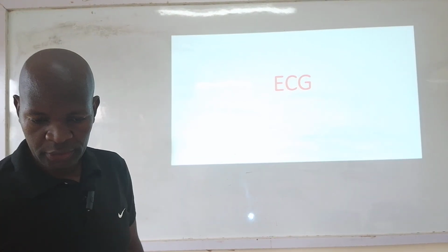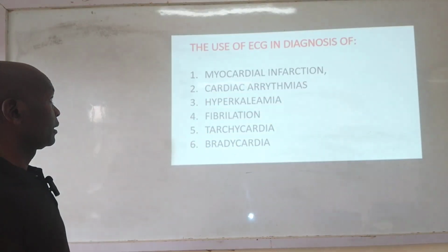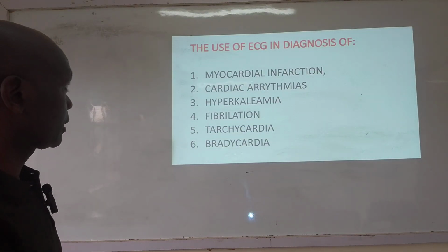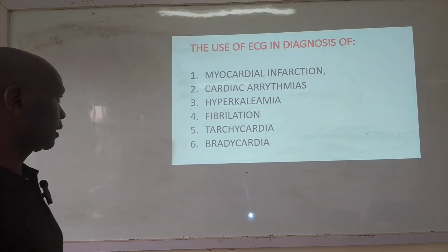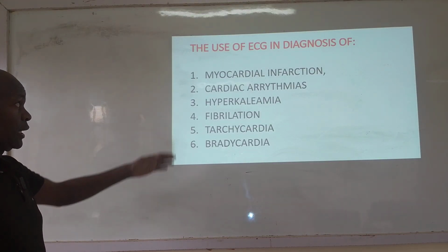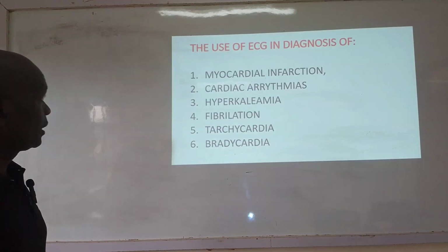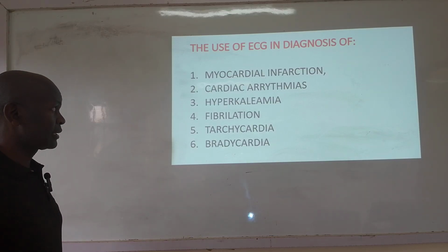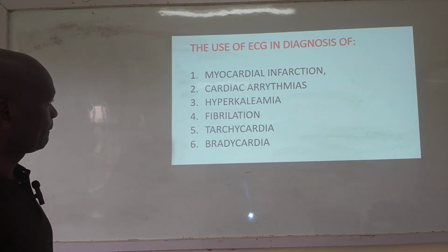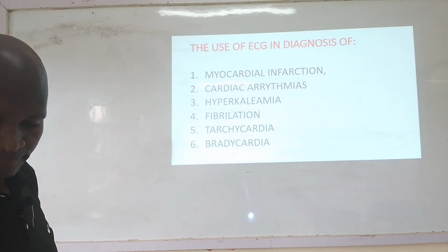Hi everyone, today let's look at ECG. ECG is one of the tests used in diagnosis of cardiac problems. One of the cardiac problems that we can diagnose using an ECG is what we refer to as myocardial infarction, cardiac arrhythmias, hyperkalemia, fibrillation, tachycardia, and bradycardia.